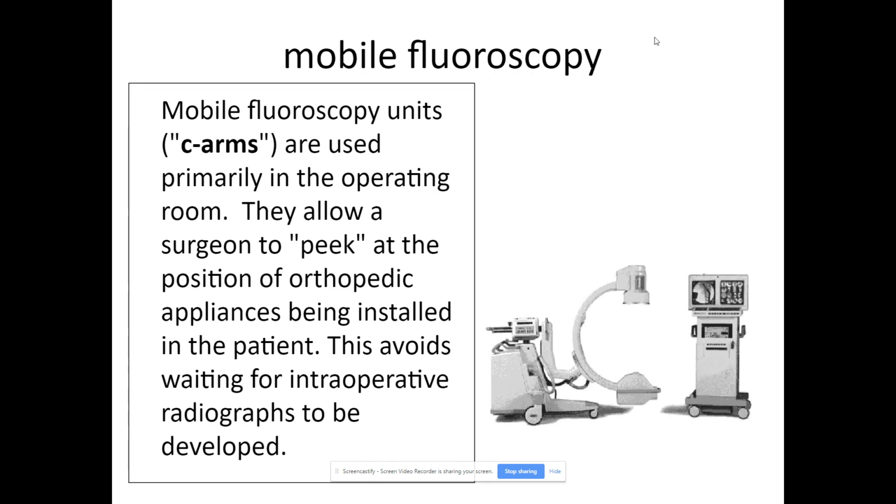So the last bit of this is mobile fluoroscopy. And in preparation for this lecture, even though I've done it a few times, I always try to check out YouTube and update myself. There are some good videos on how to use the C-arm. So if you Google that, you'll come up with a few people. And essentially, it's the same stuff, really.